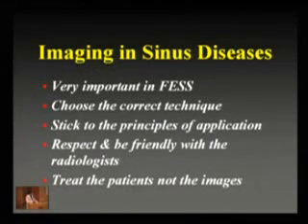And these are some of the important points that I just like to reiterate. Imaging is very important for FESS, that is for sure, and you have to use the correct technique. And the principle applies from when you order a CT scan, when you look at the CT scan, to when you decide to operate on the patient. But one thing that is very important is we should not just treat the CT scan, we should treat our patients. Because sometimes the CT and the patient's symptoms may not correlate, and then you may not necessarily go and operate on the patient.